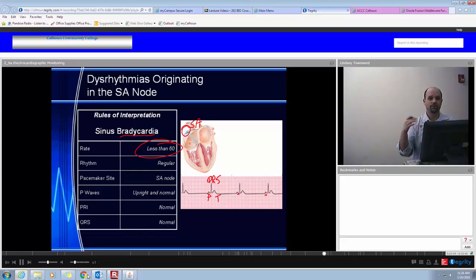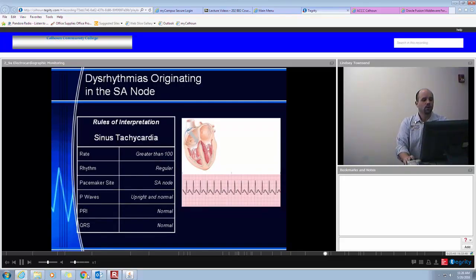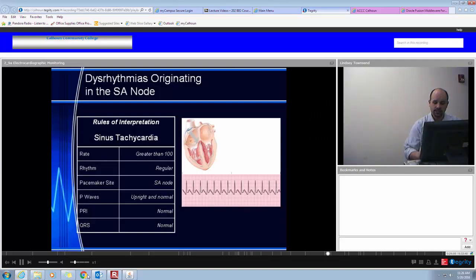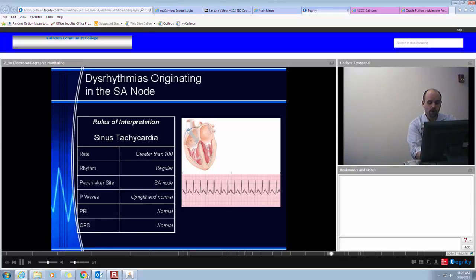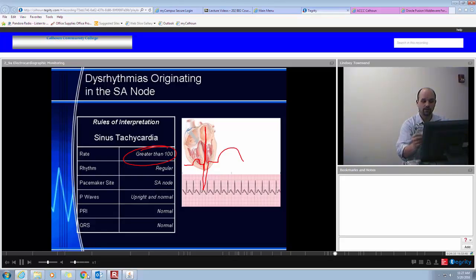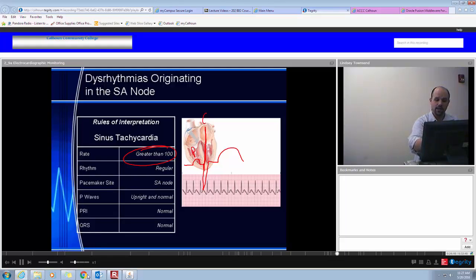Let's look at a few ECG recordings and diagnose them. The first one is a completely normal sinus rhythm. That means it's normal because the pacemaker is the SA node — no false pacemakers — and my rate is in the normal adult range of 60 to 100. Looking at each complex, I have a P wave, a QRS, and a T wave, repeating over and over. When looking for normalcy, ask: Do I have P waves for every complex? Do I have normal-looking QRS complexes? And are all the P waves upright like they're supposed to be?